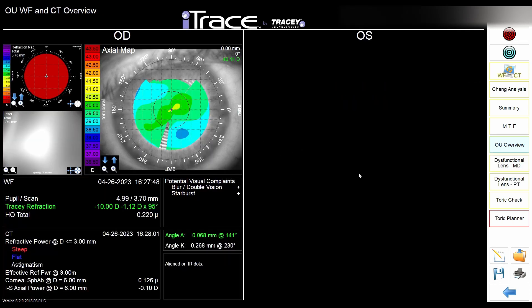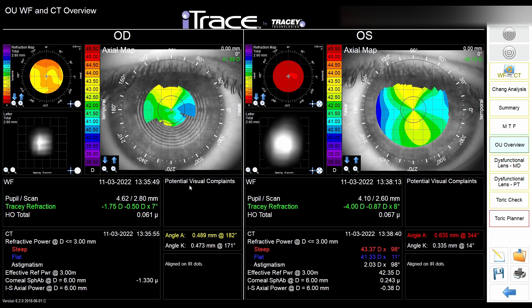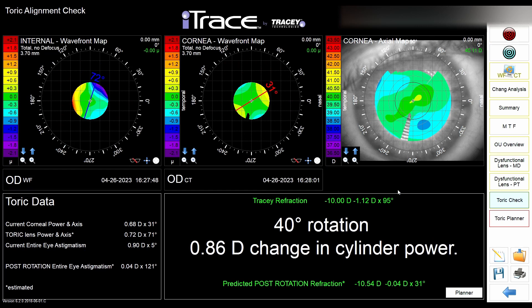This machine is aimed mostly at refractive surgery, so you have all the information: angle alpha, angle kappa, and white-to-white. There is also a simulation for rotation of a toric lens that's already implanted, showing whether it makes sense to rotate the lens or not.